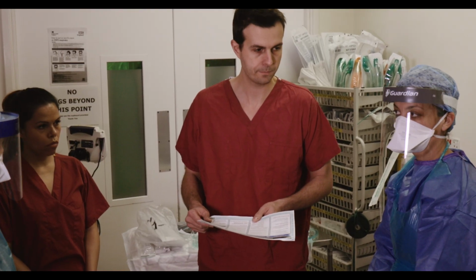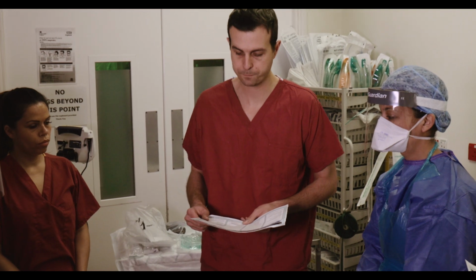5. Enter room. Any questions? Okay, let's get ready. 6.